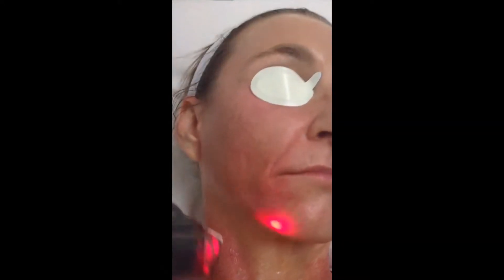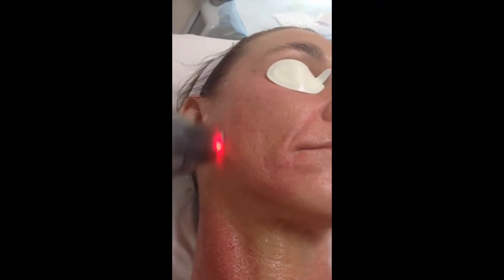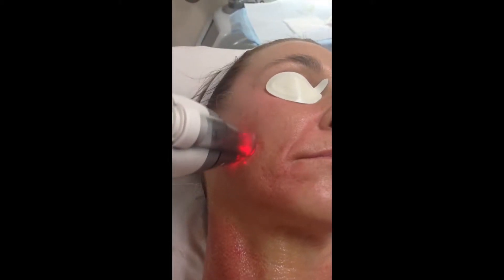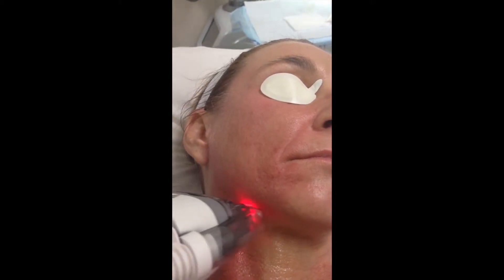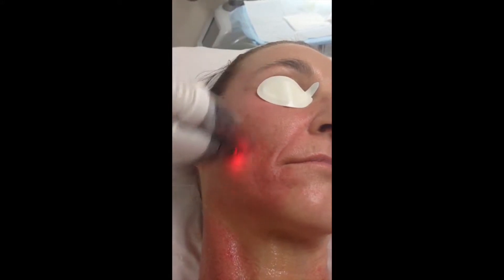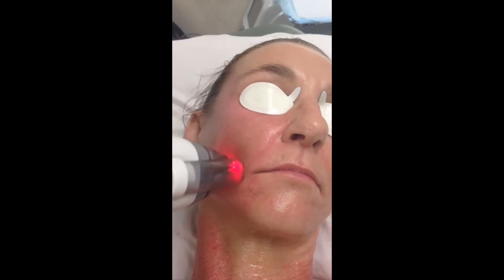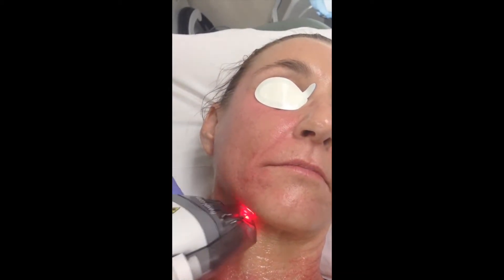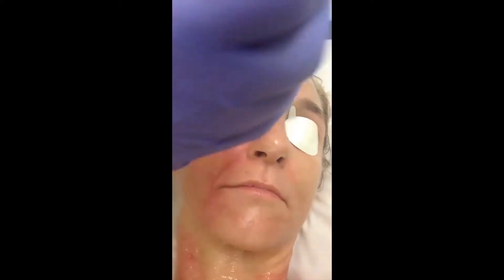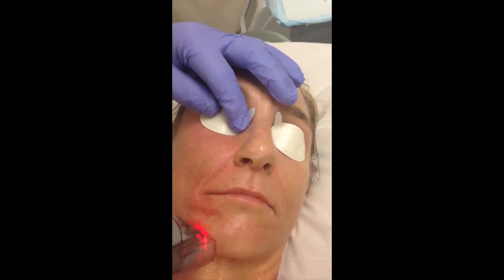I've been going in one direction. Now with a scanning device, I'm going to come in a different direction. I'm careful not to immediately overlap — if you immediately overlap in an area like this, you're going to get full thickness necrosis. So avoid that by coming back after a minute or two to avoid bulk heating. Let it cool down a fraction.